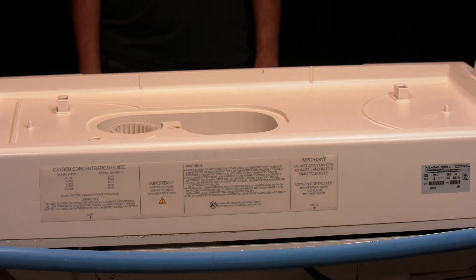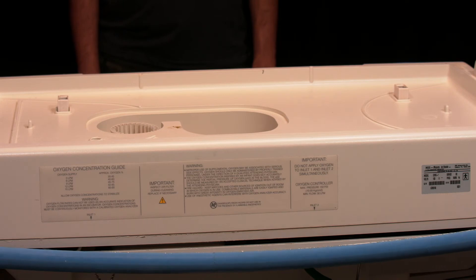There are four screws on the bottom of the infant incubator that you have to unscrew to open up the casing. Once you remove the screws, you can take off the blue seal on the sides.